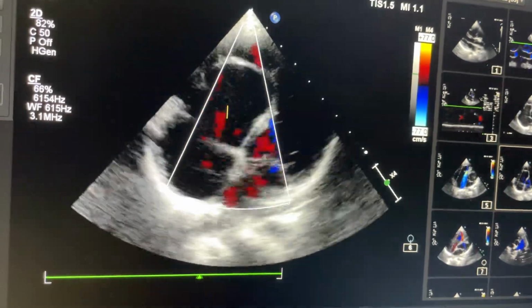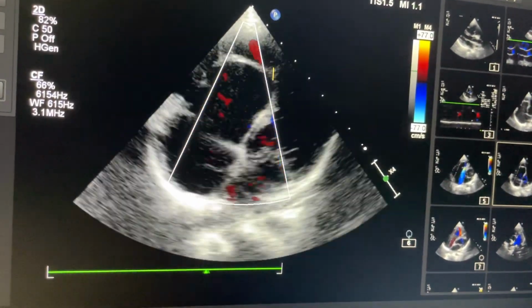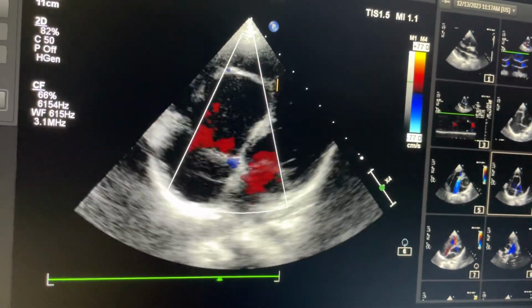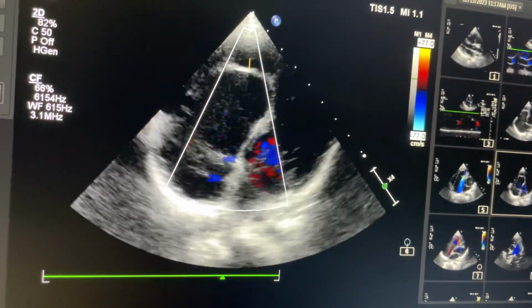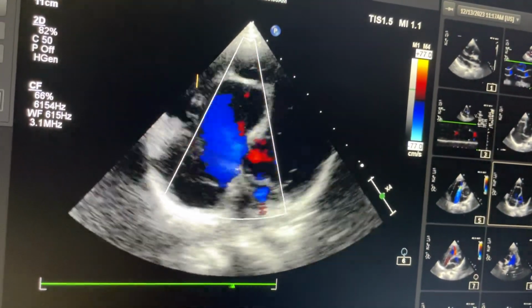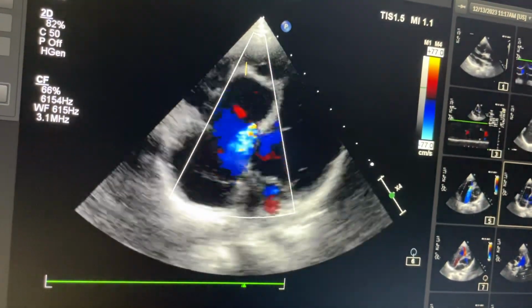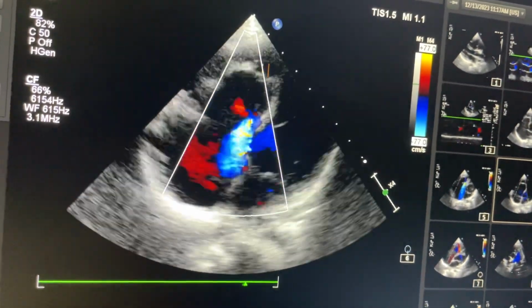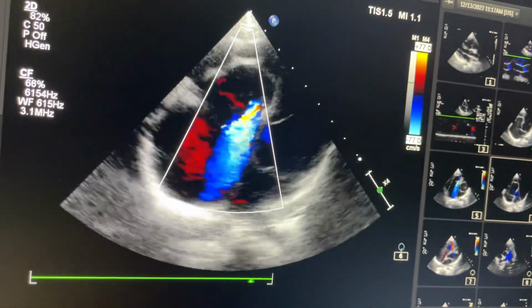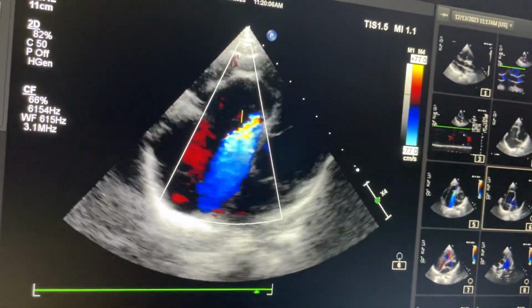In apical four chamber view, what you have to remember, the portion of tricuspid valve that is attached to septum is septal leaflet. Portion that you see other than this septal one is anterior leaflet of tricuspid valve, and posterior leaflet of tricuspid valve is only seen in right ventricle inflow view, that is modified parasternal long axis view, inflow view.